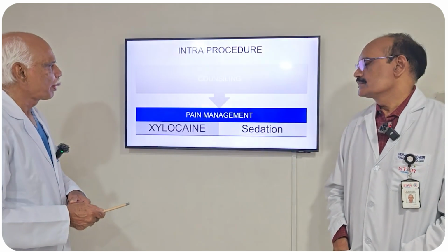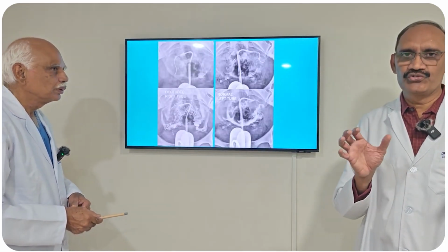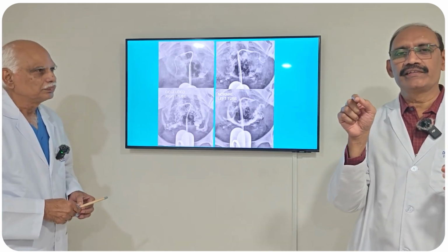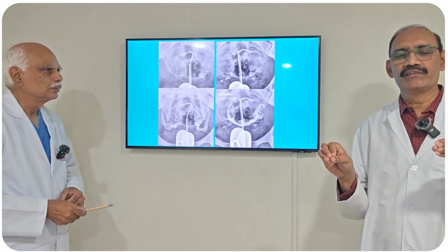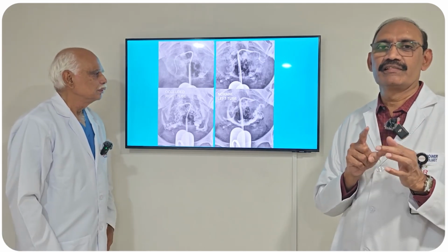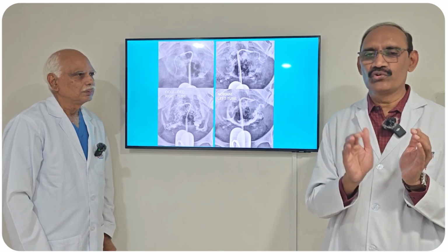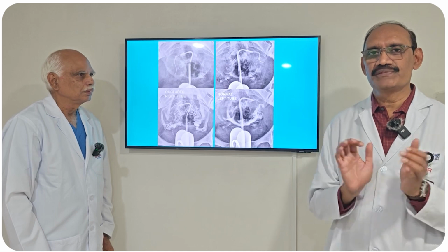Next. In a single sitting, we evaluate these tubes, diagnose the problem, and put a small cannula and catheter into it and dilate it so that the contrast goes into the peritoneal cavity. So it's both a diagnostic as well as a therapeutic way of doing things. In a single sitting, we are doing both. That's the advantage of fluoroscopy over the static X-ray conventional HSG.